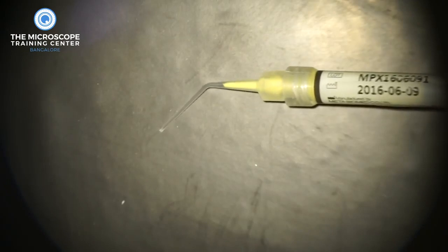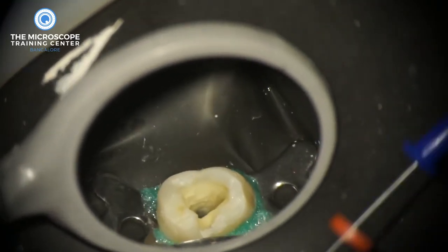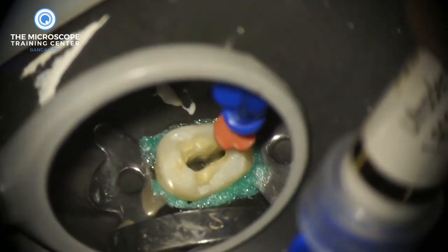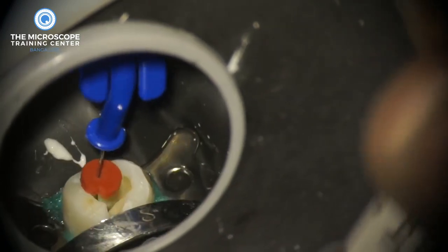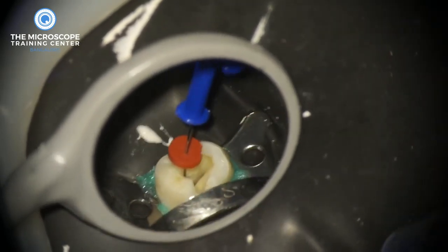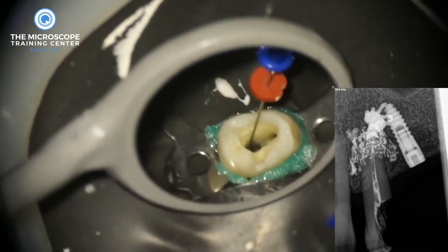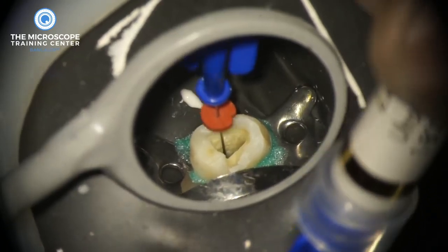You can see how slowly Metapex flows. You select the navy tips, place them in the canal — but before that, adjust the stopper. First, we inject a little bit outside the tooth to make sure it's flowing, because sometimes navy tips do get clogged. Once you confirm it's not clogged, insert it into the canal and adjust the stopper to make sure it's within the working length. The second step is to make sure it's not binding in the canal. If it is binding and you start injecting, you'll get the kind of complication seen on the radiograph. When you pull the tip it should move freely.